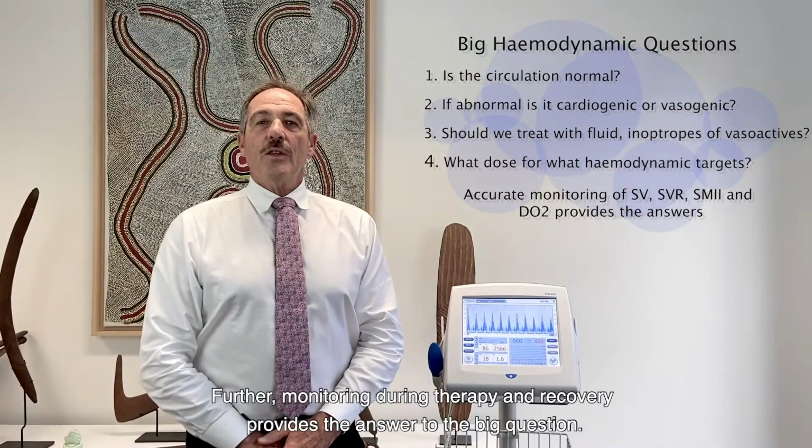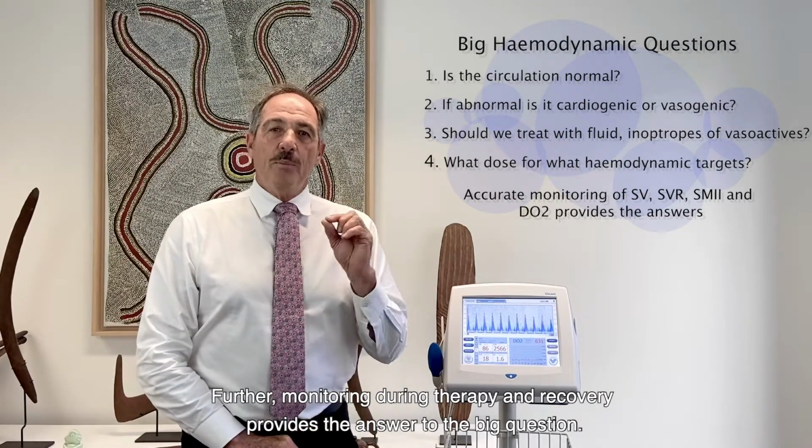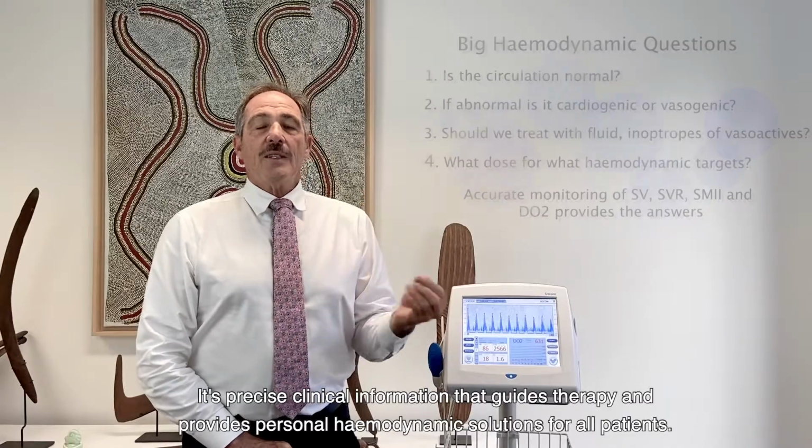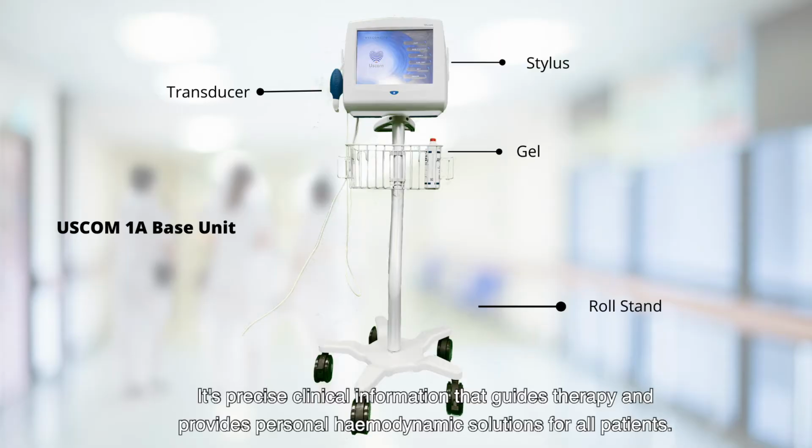Further, monitoring during therapy and recovery provides the answer to the big question, and that is precise clinical information that guides therapy and provides a personal haemodynamic solution for all patients.